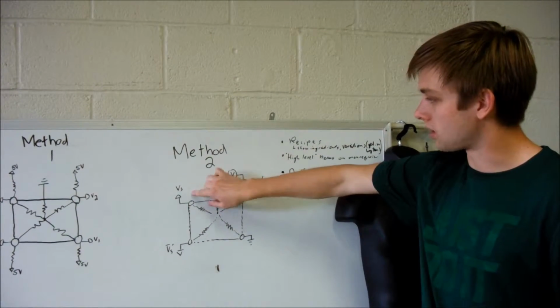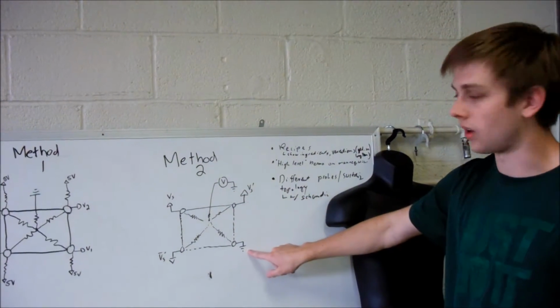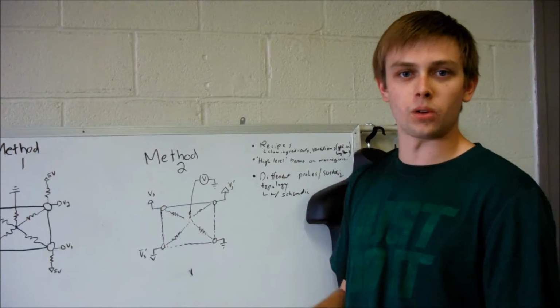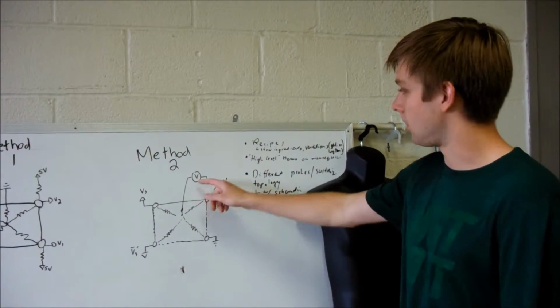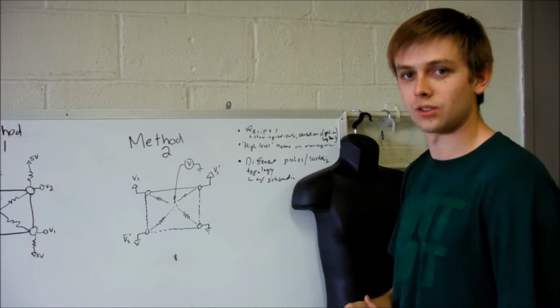We've got voltage supply switching from the sides to the top. This corner is always grounded, and then the probe that you're using, that would be the scalpel or whatever, is the voltage meter, and that connects directly to the Arduino and would be measuring a voltage.